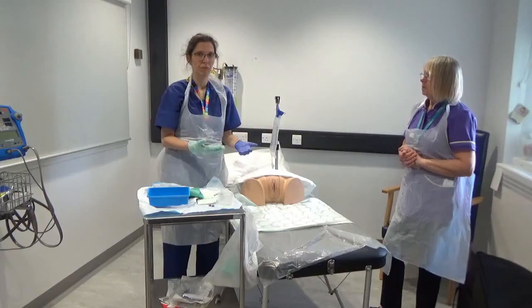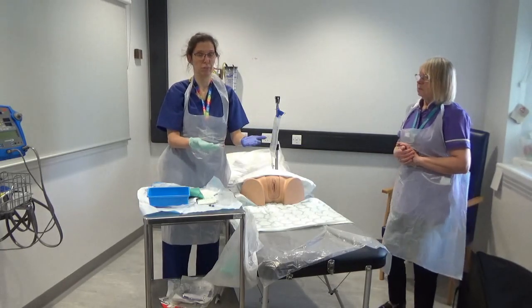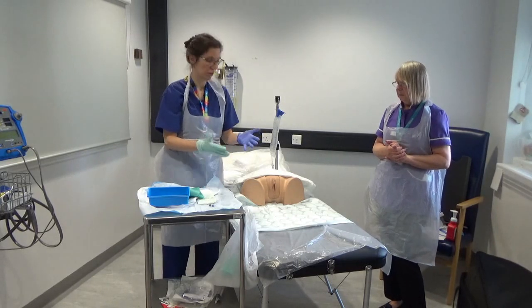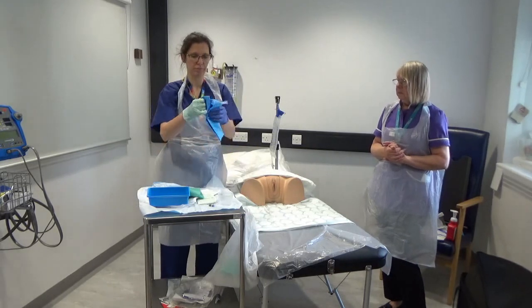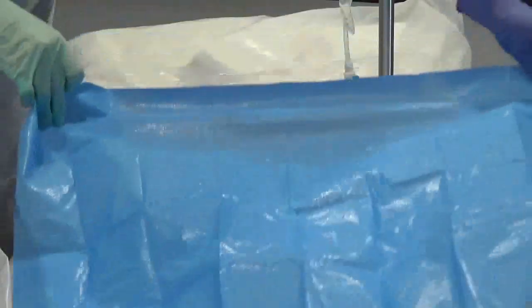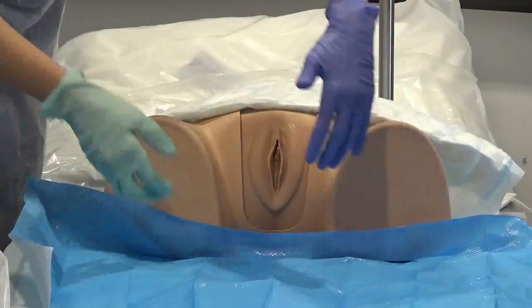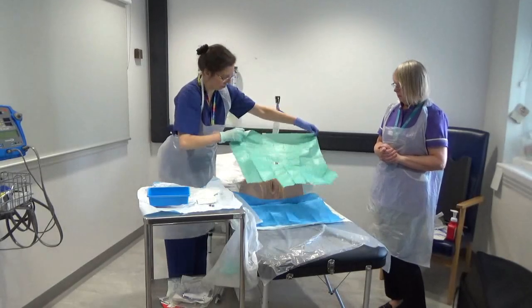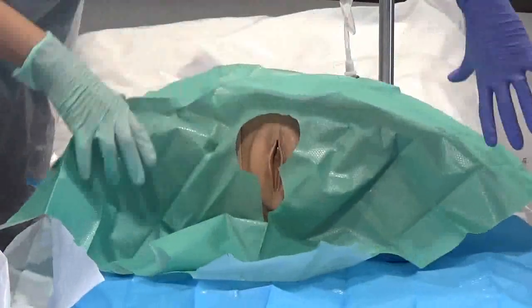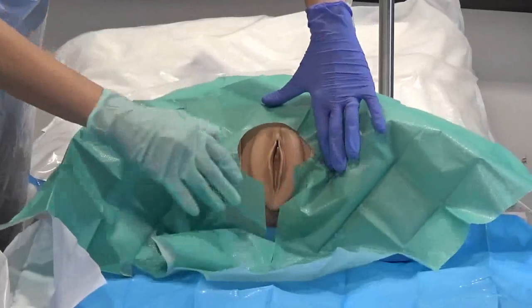After gelling my hands again, I've put my second pair of sterile gloves on. Now I have a dirty hand and a clean hand — obviously in practice you wouldn't have different coloured gloves; this is just to demonstrate the technique. I now need to make a sterile field around the patient. I use this sheet and put it under the patient, tucking it in nicely under the legs. Then take the other sheet — in this trust we have a sheet with a hole in the middle. If you don't have one with a hole, put a sheet over the top with the middle bit exposed, or tear a little hole in the middle. These holed sheets protect everything quite nicely and leave you a lot of space to work.